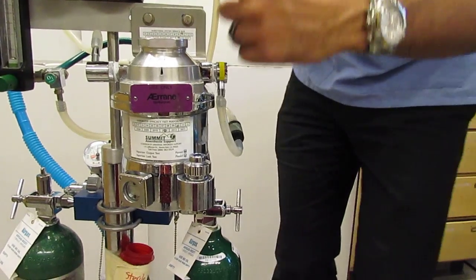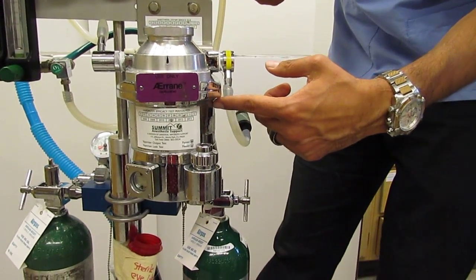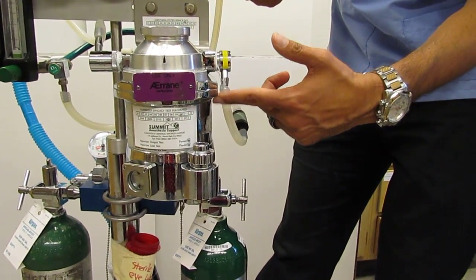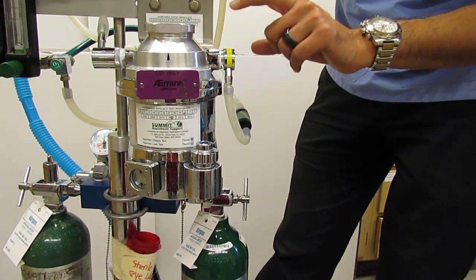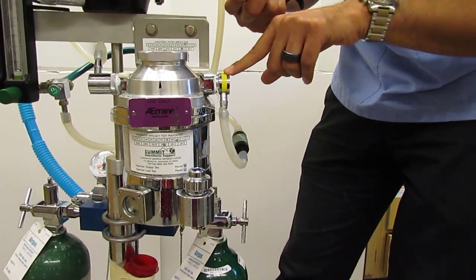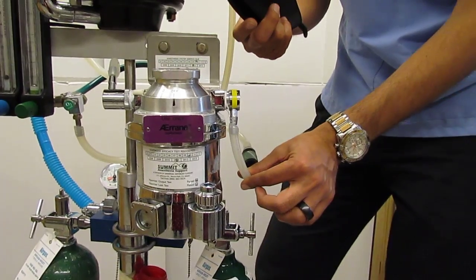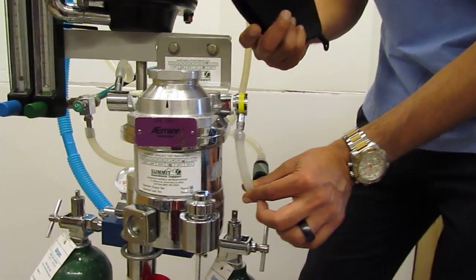Then, we pick up the anesthetic gas. The oxygen picks up the anesthetic gas in here in the vaporizer, and then it comes out through the vaporizer outlet. What is leaving the vaporizer is now a mixture of anesthetic gas and oxygen.